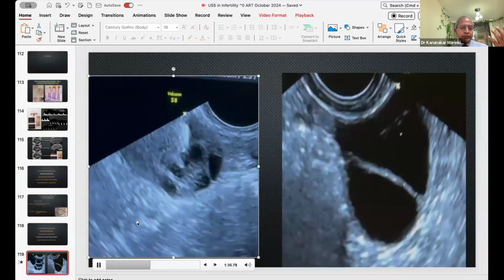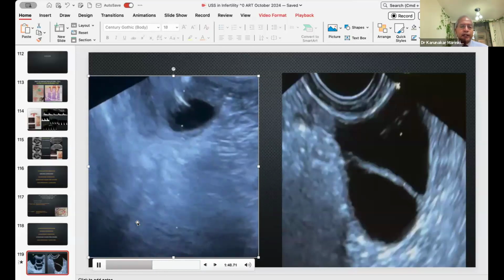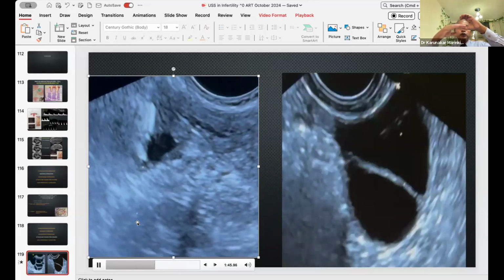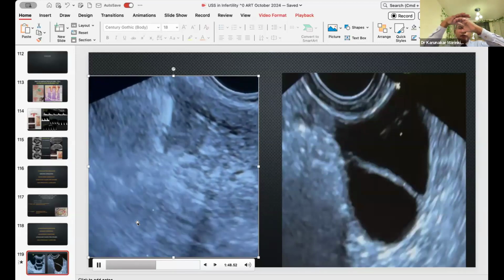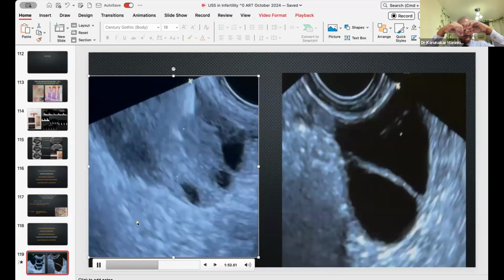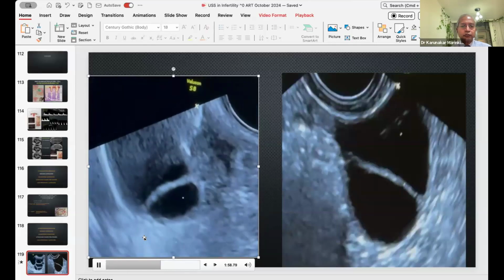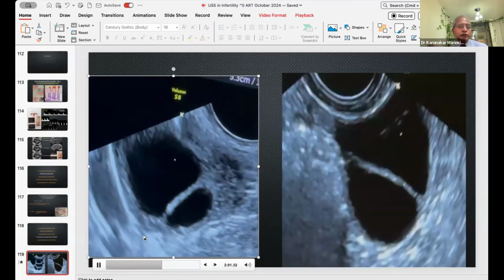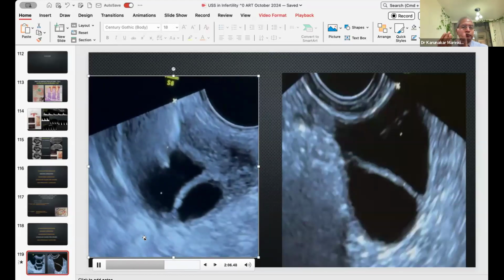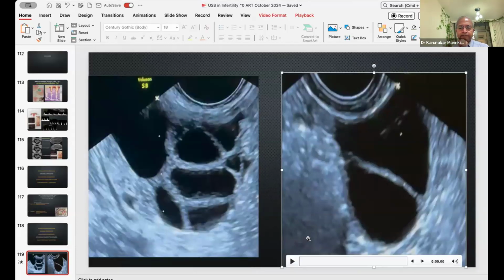Go to the center, withdraw a bit, scan the follicle from front, back, east, west, each follicle. And you perforate the ovary in the widest part to begin with. Don't puncture whatever you see. Go to the middle of the ovary. Some follicles are in the east, some west, some north, some south. You enter in the center so that with one puncture, you can collect all of that. First see what is the best way to enter them, and think before you perforate. As soon as you see, don't draw. You may be in front of the follicle. Follicles are so soft that if you push firmly, the needle can perforate the follicle.